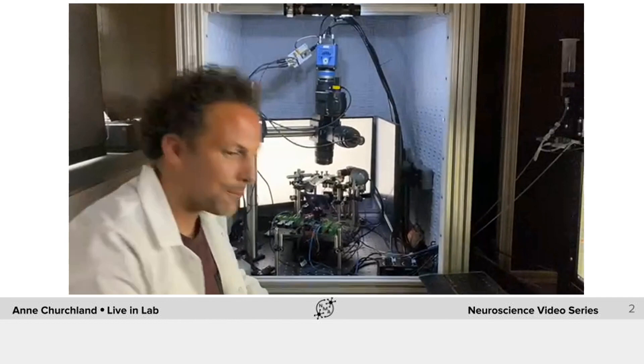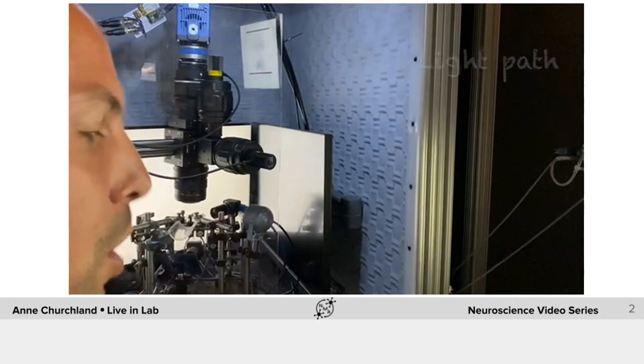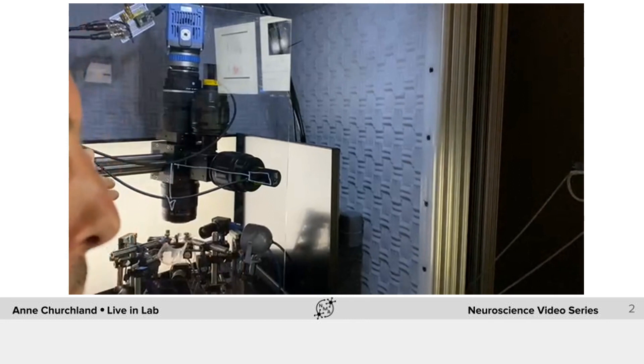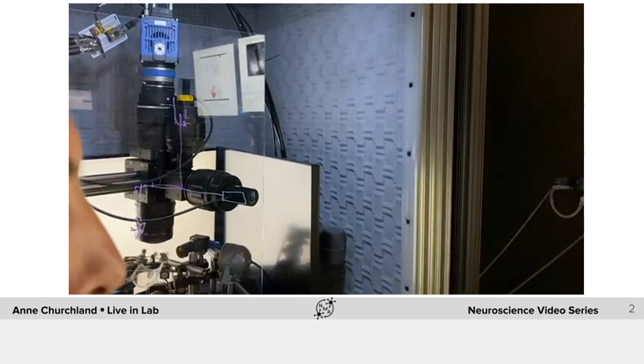Sure Ann, let's look at it. So the setup actually consists of two different modules. There's an excitation module where we have a blue LED that sends light straight into the mouse brain and a violet LED also on the same module that sends light so that you can correct for hemodynamics.